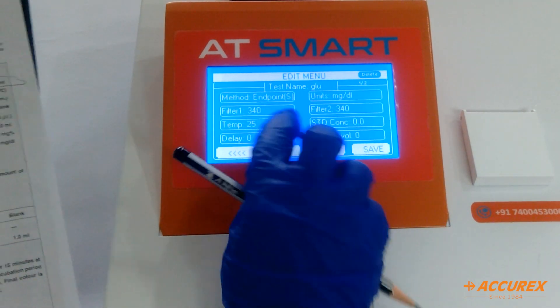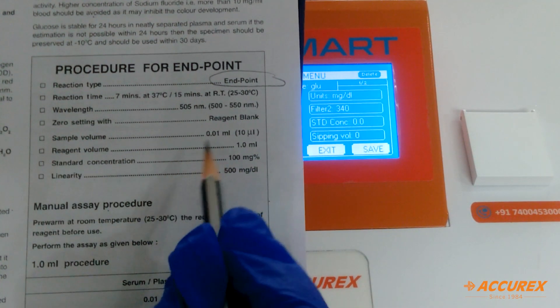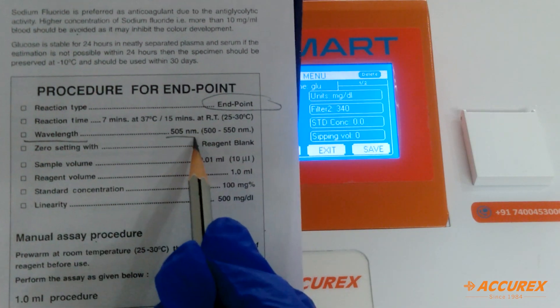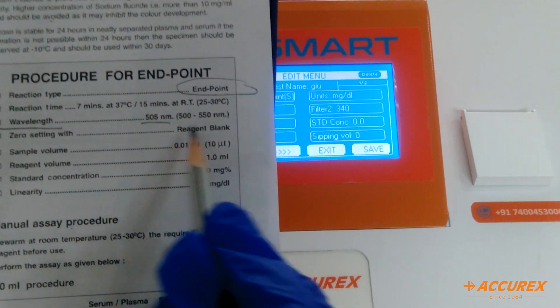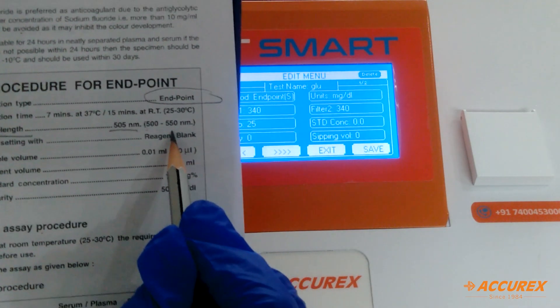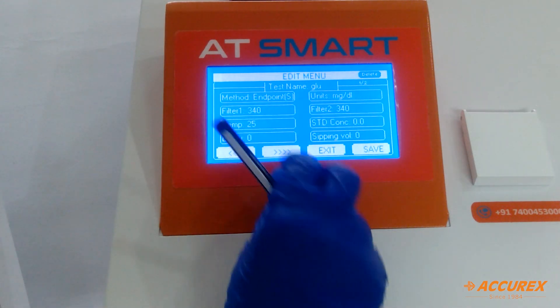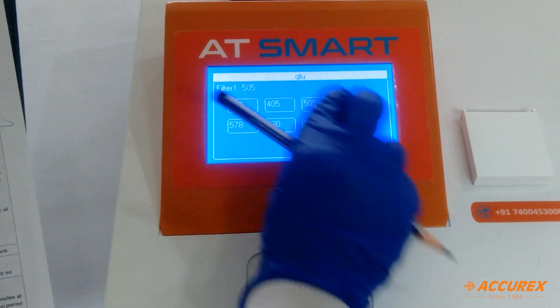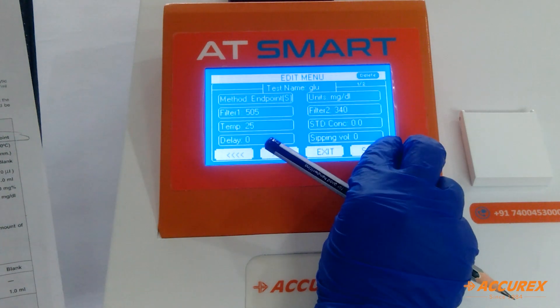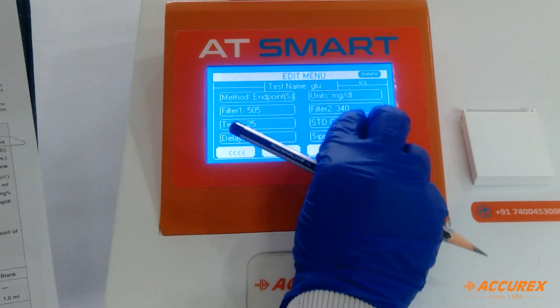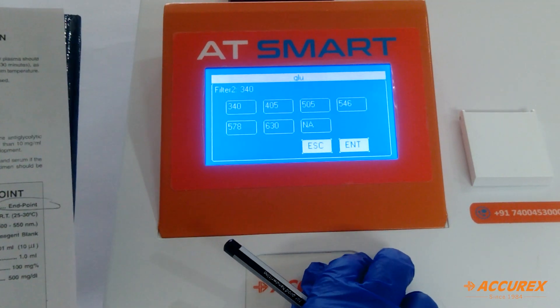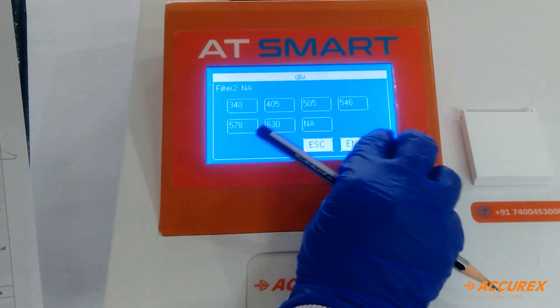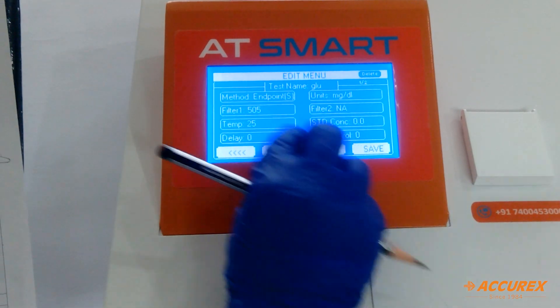Next is filter. Wavelength is 505 nanometers, that is 500 to 550 nanometers — press 505 and enter. Second is filter 2. Because it is endpoint chemistry, filter 2 is not mandatory. Press Na and enter.